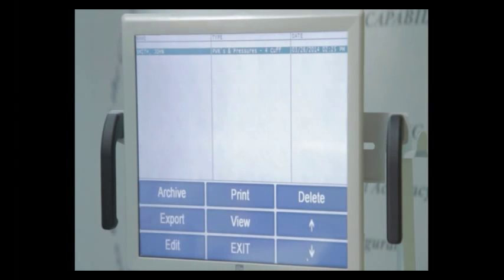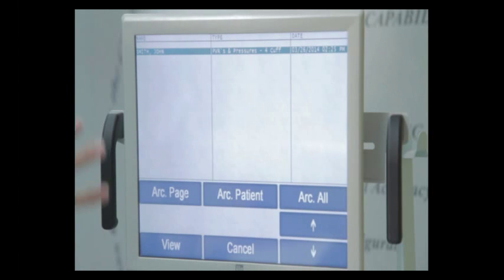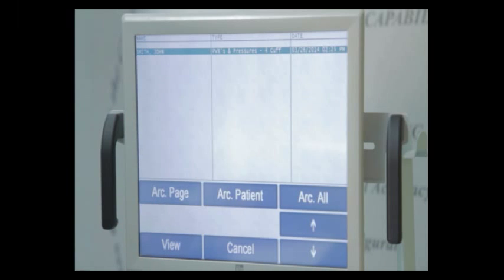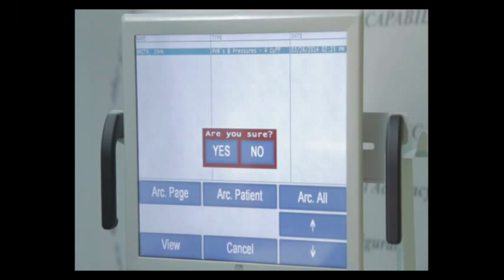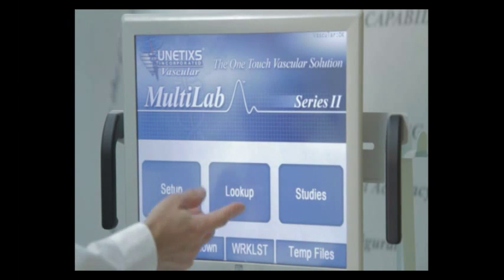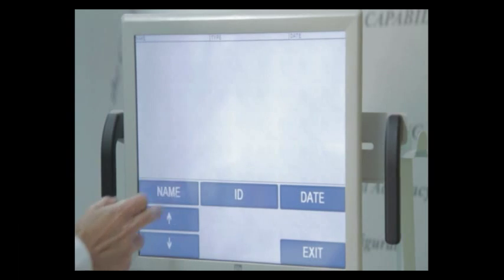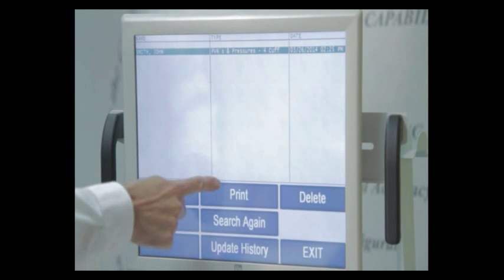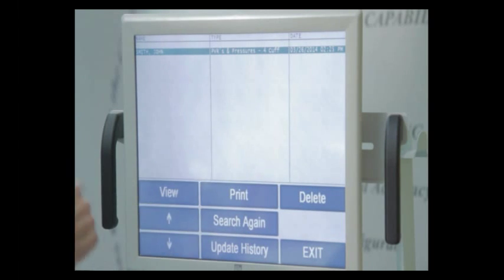So I'm going to now archive this study. And when you press archive, again, you can do page, patient, or all. I've just got one page, so I'm going to archive the page. And am I sure? Yes, I am. Now you'll notice the patient is gone from the temporary file, and I can now find that patient using the lookup button. I'll press lookup, type in name, and that's going to be Smith. There's my patient. Now you'll notice I can print it, I can delete it, but I cannot send it to PACS. So that's why you want to send it to PACS first, print it if you want to, and then archive it.